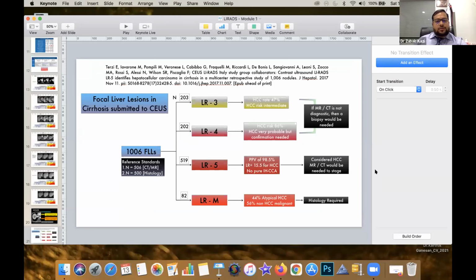And I think the last question is: is washout defined with respect to liver parenchyma or arterial phase HU? That's a great question, but typically it's a temporal enhancement of the observation itself, but with respect to the parenchyma. So, let's give a standard example of what happens in an HCC.